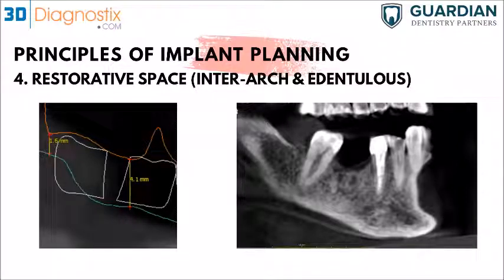So all this stuff we take into consideration, and we find out when we plan a case. We always look for any concerns, any problems, just to make sure that we have an anticipated procedure, and make sure it's as easy as placing the guide, drilling the osteotomy, and placing the implant.